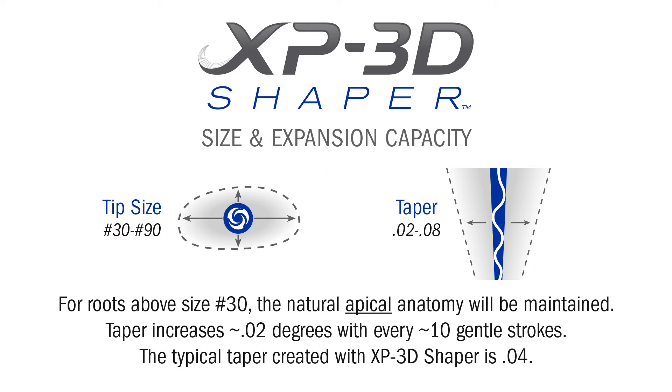The taper created by the XP3D Shaper is based on the number of strokes and will vary based on user preference. The typical taper is 0.04.